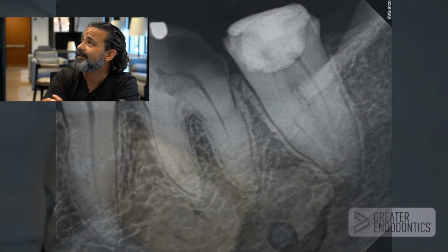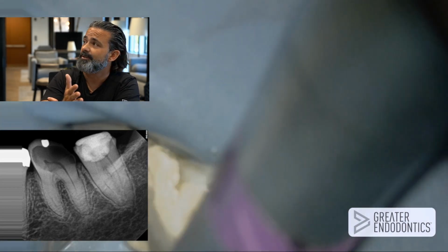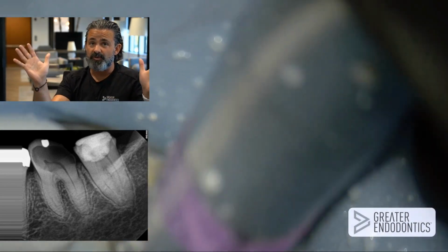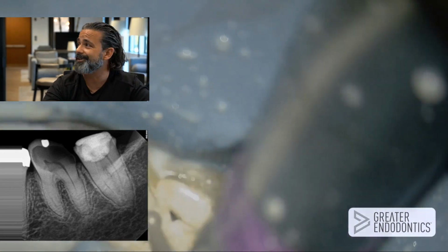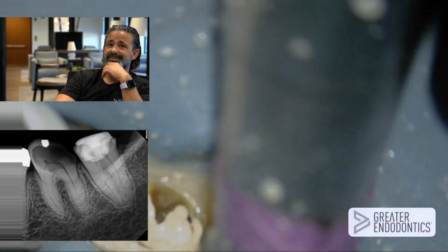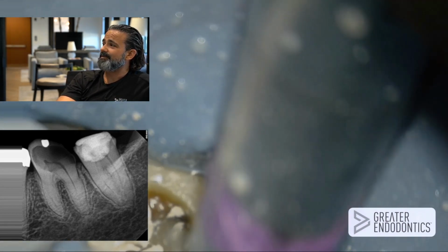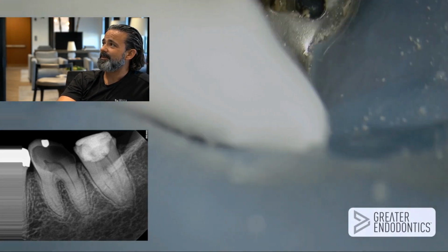Comment. When you look at it, the dentist had already removed the decay, which I love, because that puts the question of can I put a crown on it on the dentist's shoulders, which is what occurred. So far so good. I've got to move this here and get this in focus for you. Let's move this up a bit. I'm removing the IRM that was placed in there. Bear with me. Here we go.